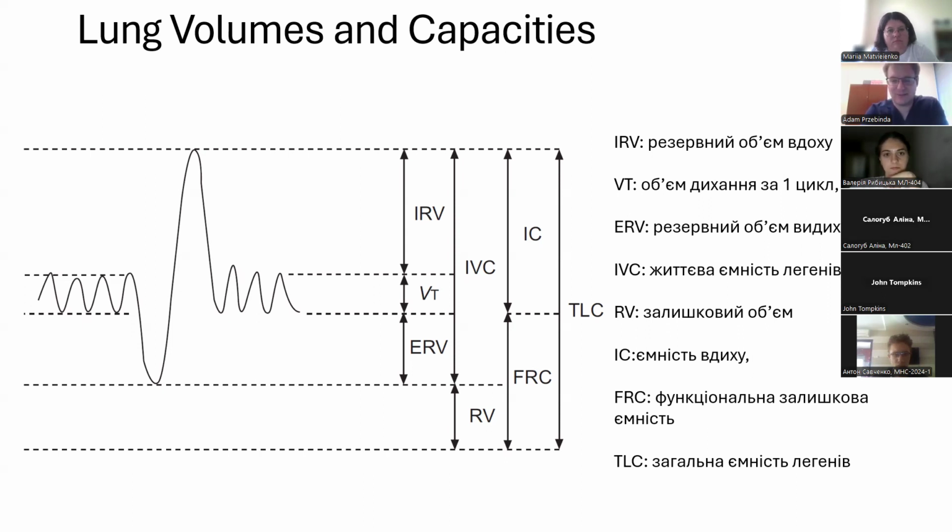There's all the simple things like, if someone is sick, we don't do it. If somebody has had a heart attack, we don't do it. If somebody has some kind of open chest wound, we won't do it. If somebody cannot follow directions reliably, this comes up more so in people that have brain injuries or something like that, where they cannot follow directions. There's very few things that are real contraindications, I guess. It's a safe thing. It's not a dangerous thing. Okay, thank you.